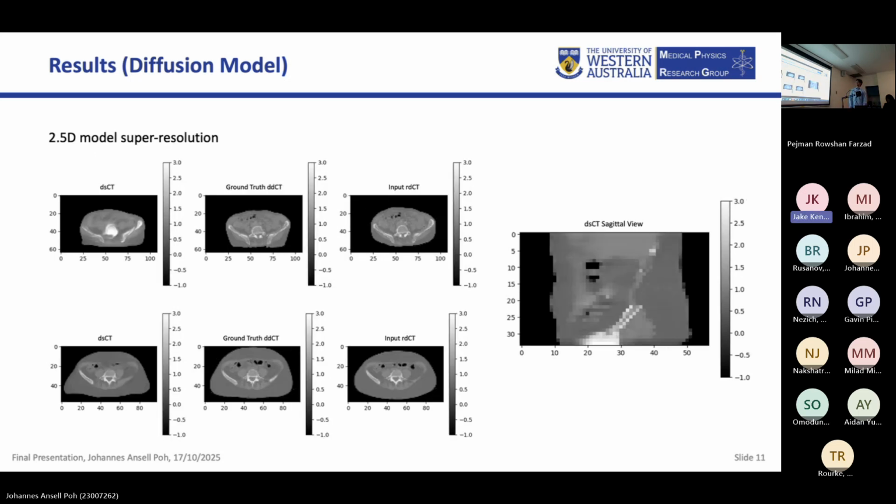I even tried using super resolution on the pixelated image to generate a higher resolution CT image. It sometimes produces good looking images, but in other images, it fails to generate the details. So after talking to Jake, Mubasha and Du, we suspect that there's not enough images in the training set to properly train a diffusion model.